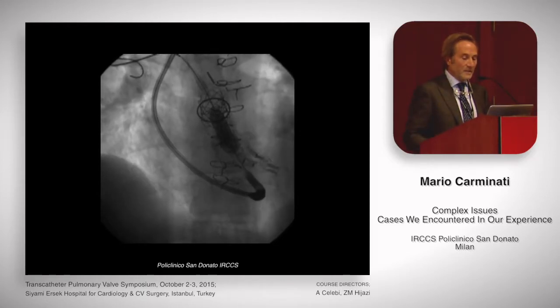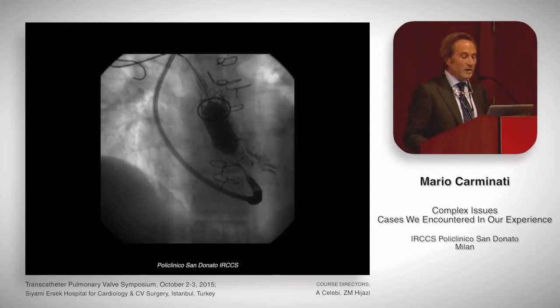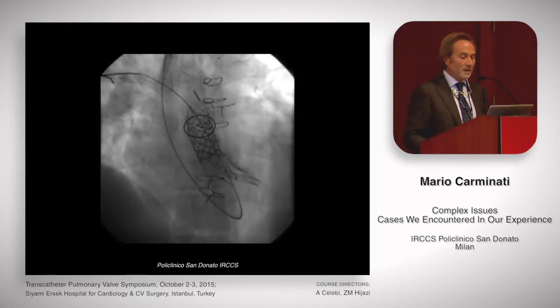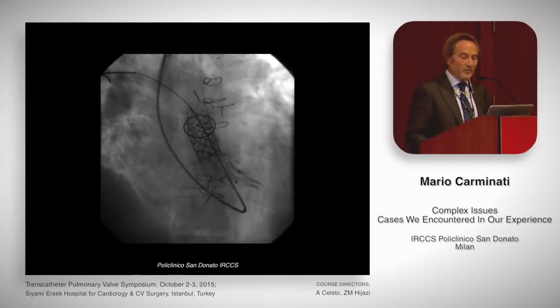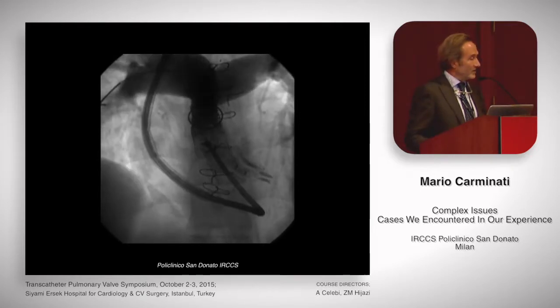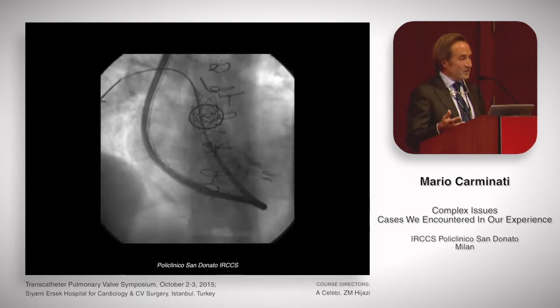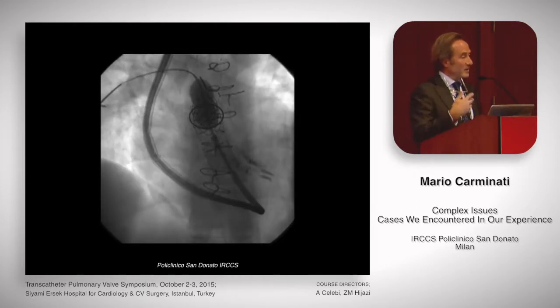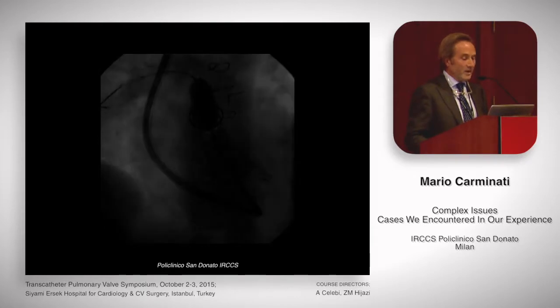You see here inflating the inner balloon, then the outer balloon, and that's the final result. With no regurgitation and significant decrease in right ventricular pressure, we were very happy. We closed the residual VSD and fixed the Melody with a second valve in situ. The patient did very well.